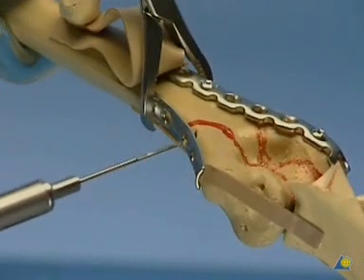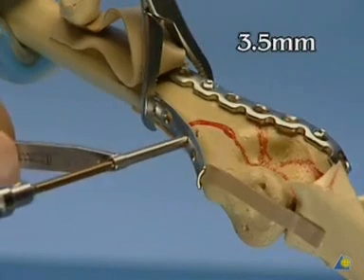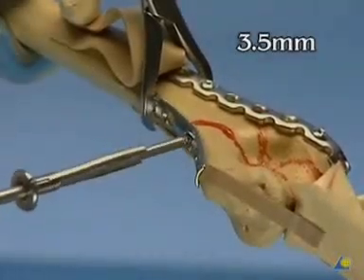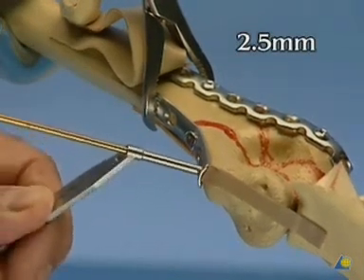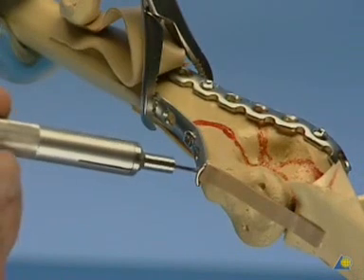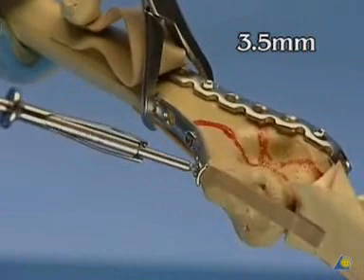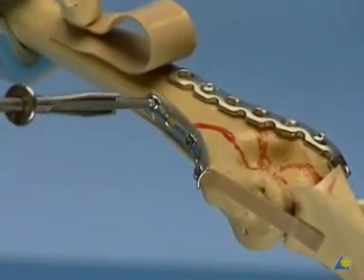Measuring the length. Tapping. And screw insertion. In case of a 6-hole plate and good bone quality, as in our model, the addition of only 2 more screws at either end will suffice. The screws are tightened.